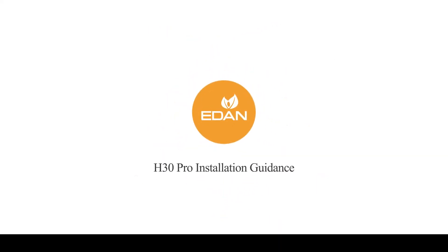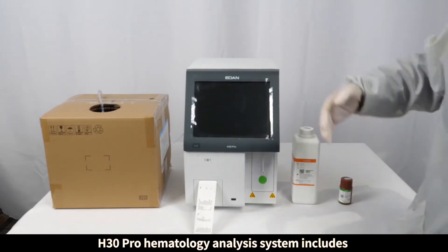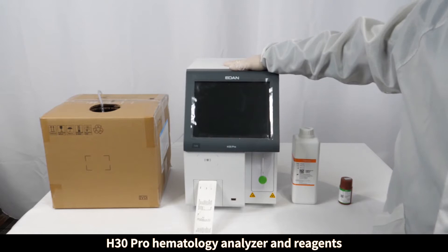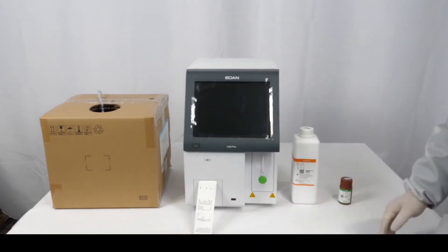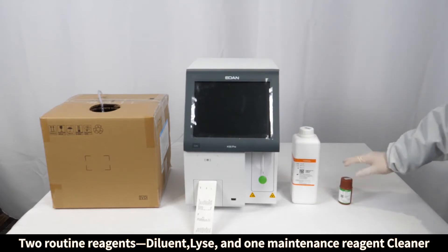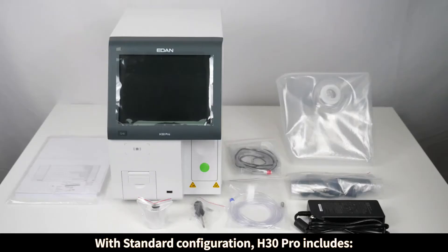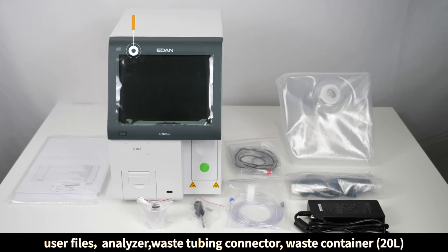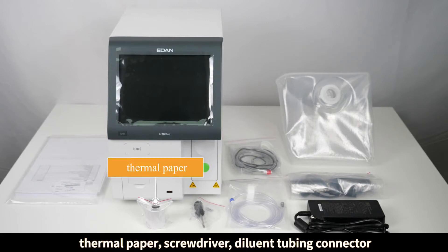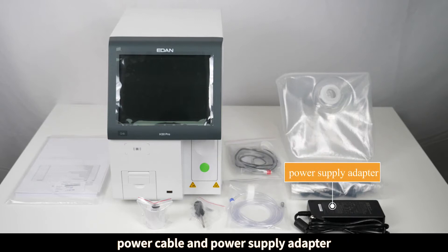H30 Pro installation guidance. The H30 Pro hematology analysis system includes the H30 Pro hematology analyzer and reagents: two routine reagents — diluent and lyse — and one maintenance reagent, cleaner. With standard configuration, H30 Pro includes user files, analyzer, waste tubing connector, waste container, 20L thermal paper, screwdriver, diluent tubing connector, power cable, and power supply adapter.